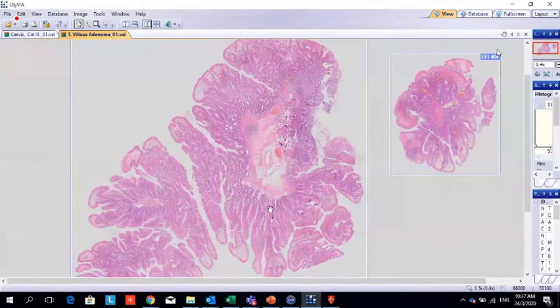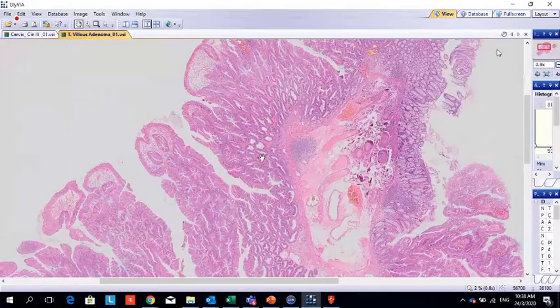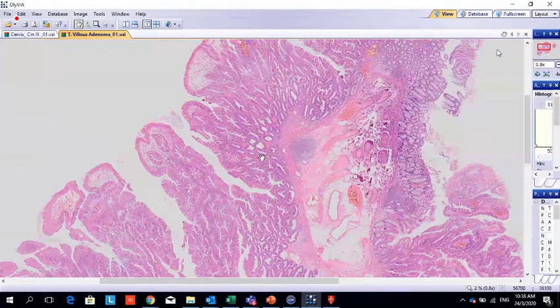You know the lamina propria, remember? The lamina propria of mucosa, we said, is within the glands. No, sorry. I think the stalk is connecting to the submucosa, because submucosa has this kind of blood vessels and connective tissue.